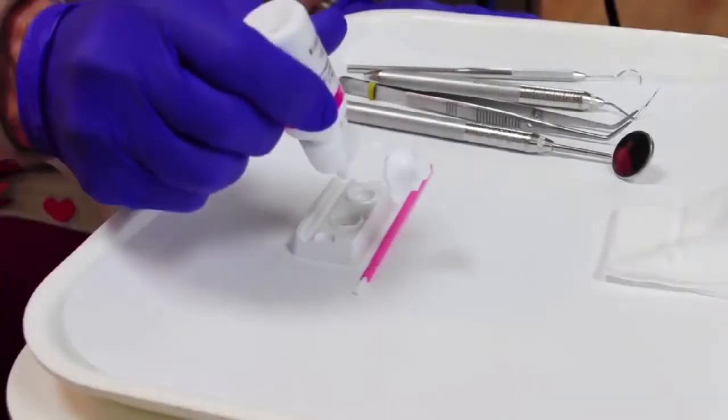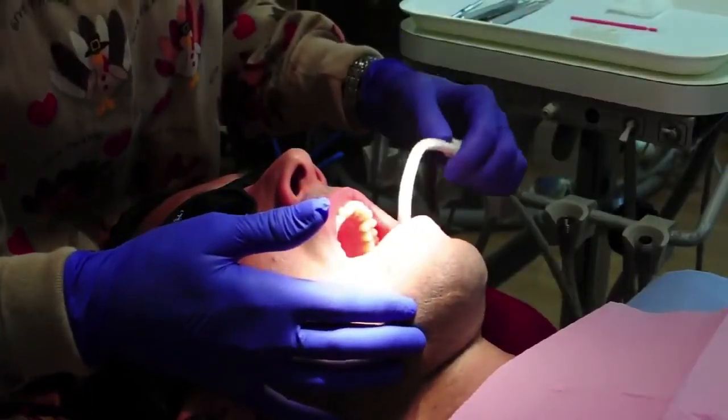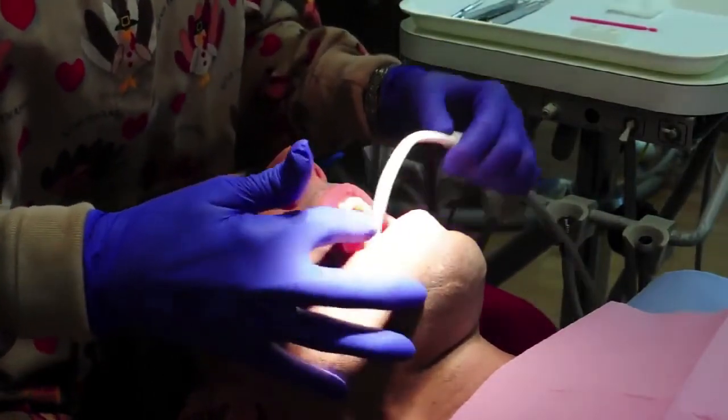Use an alcohol wipe when needed to clean the bottle tip prior to storage. Don't dry the teeth, but do evacuate pooled saliva. You want the dentition to be moist, since Floramax is thin and migrates on moist teeth.